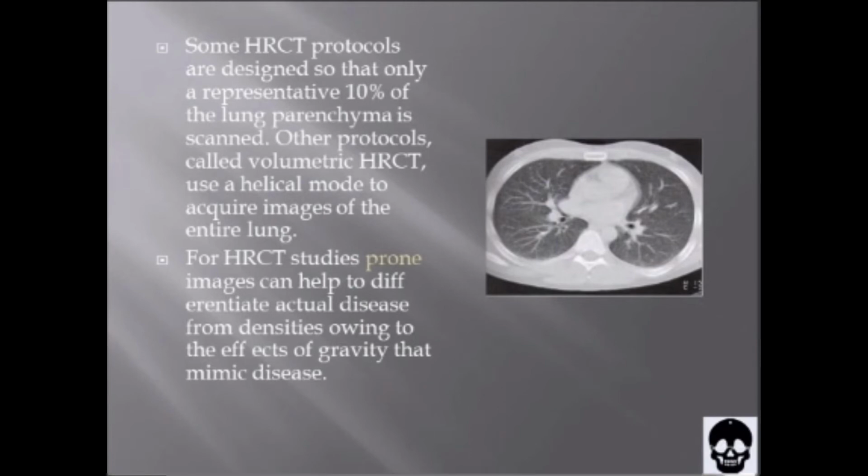When the lungs are fully expanded, the contrast between low attenuation aerated airspace and high attenuation lung structures is maximized. Therefore, high-resolution CT protocols are routinely obtained at full inspiration. However, expiratory images are useful in many instances. For example, expiratory images better depict bronchiolitis and air trapping. The density gradient from the effect of gravity is more pronounced on expiratory images.